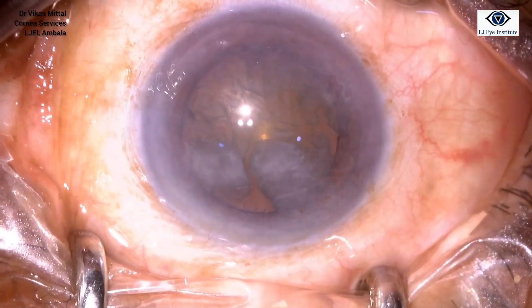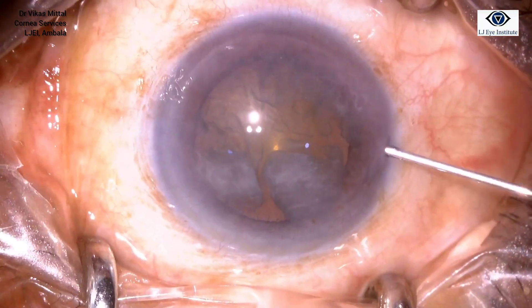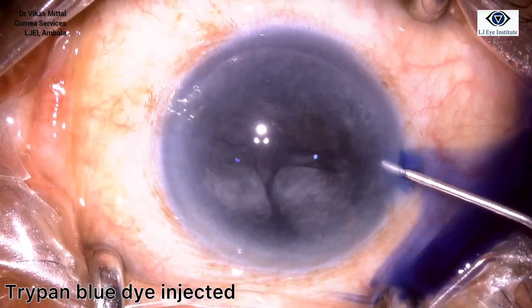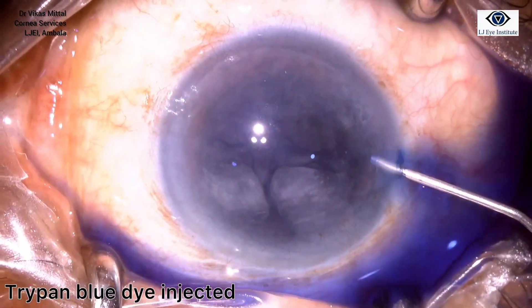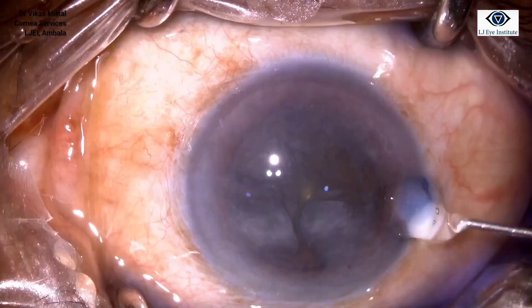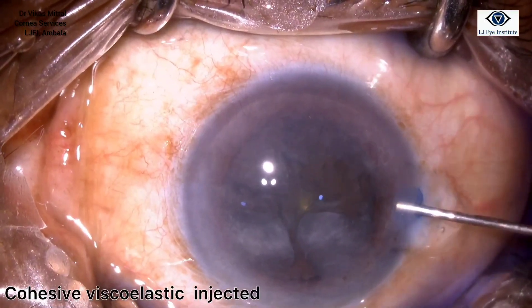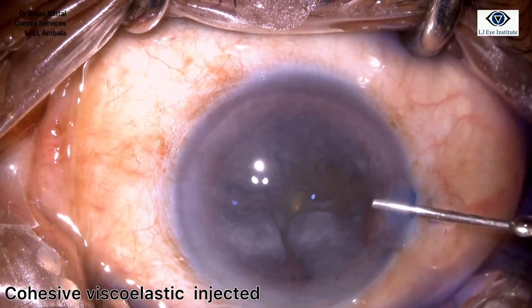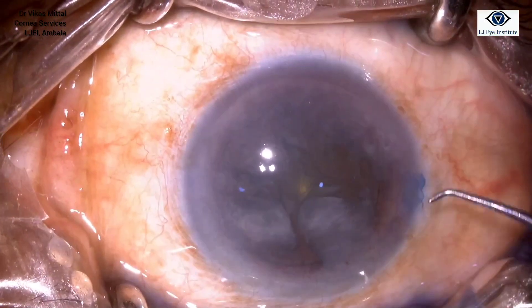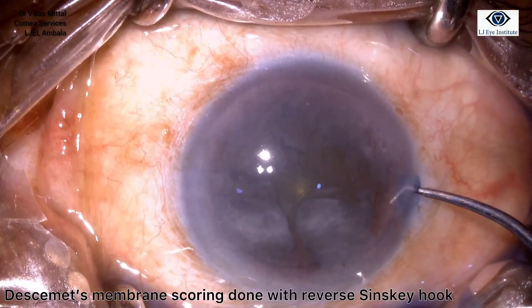After creating a sideport at the 10 o'clock position, trypan blue dye is injected to check whether these deposits take up any stain or not. We found out that they do not take up any stain.